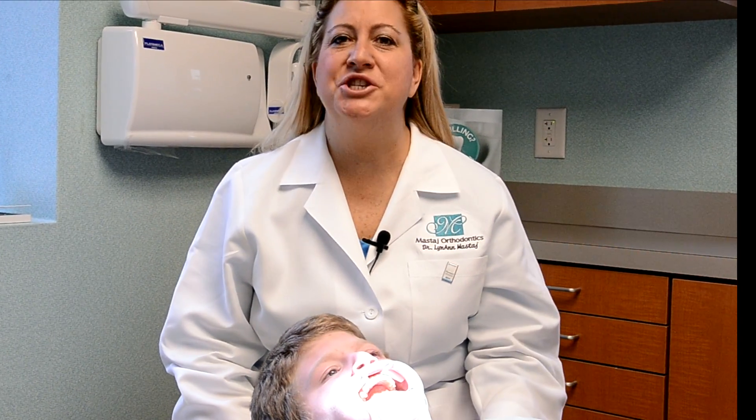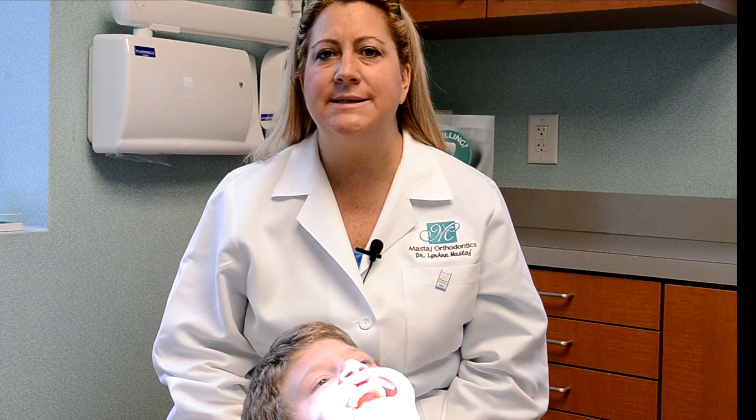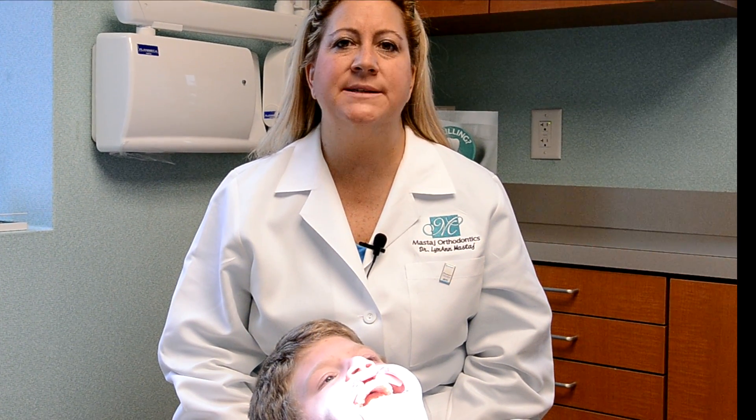Today I'm actually going to do a demonstration on how easy it is to treat white spots and incipient caries. This is my patient Jason, and today we're going to be doing his incipient caries on teeth 7, 8, and 9, and we're going to be doing some surface white spots.